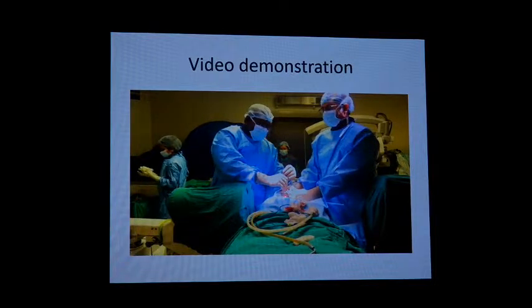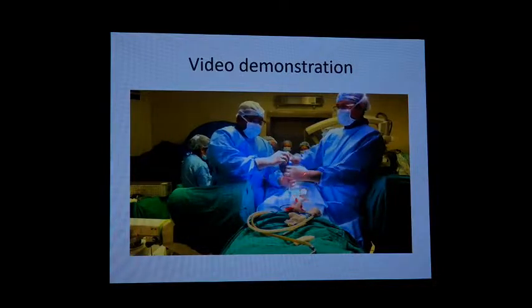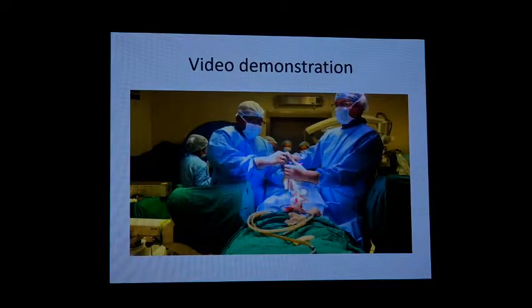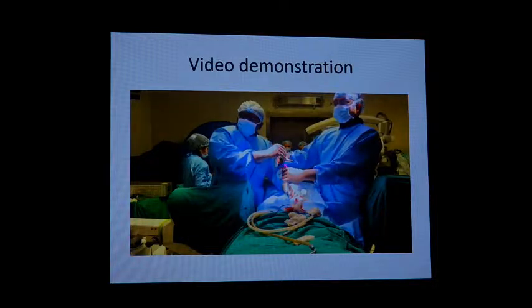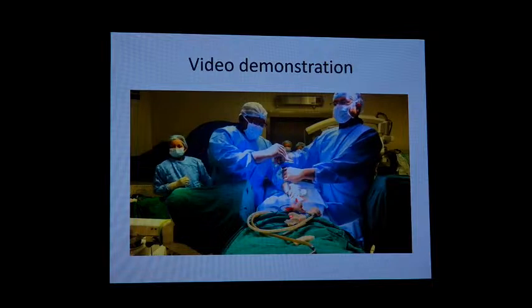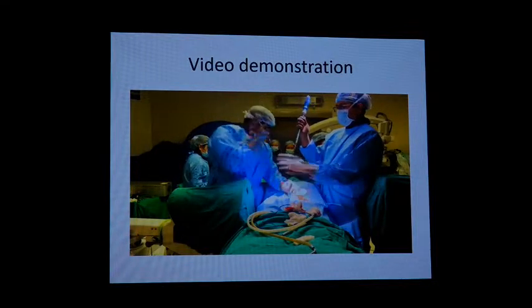And once it's confirmed, make sure you stabilize. We use the tap. An important thing is, you can see, one hand is stabilizing the K wire so that the K wire does not get dragged inside. So once the tap is done, next is the screw placement.